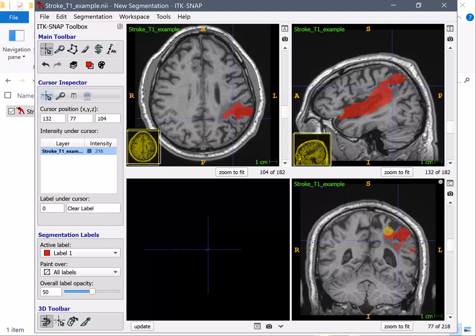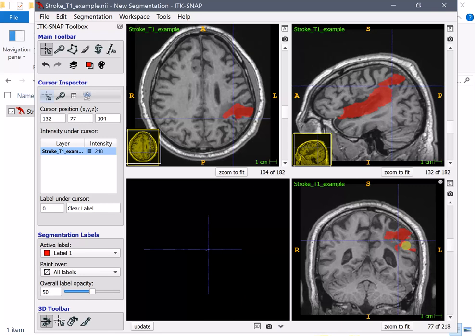And once you interpolate like this you can still keep drawing to fill the lesion in other axis. The next question you may have is well can I draw on another axis like for the example the coronal here and interpolate again maybe yes maybe no I haven't tried that yet but this is already a huge improvement in speed for manual lesion segmentation thank you.